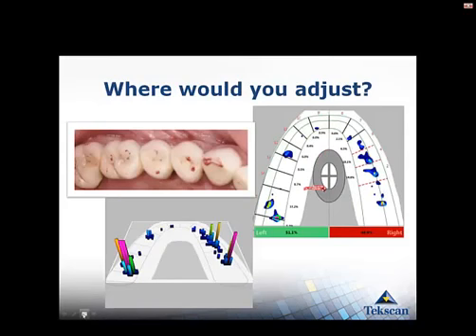And so let's go back to this again, now that you're more informed on what TScan is. When you guys are in your practice tomorrow, how are we going to make educated decisions as to what to do with this? If we had TScan, we would know that this contact back here, which this tooth has 37% of the force on it, and this contact that's here only has 6% of the force on it. And so it really gives us that valuable information to make better decisions.